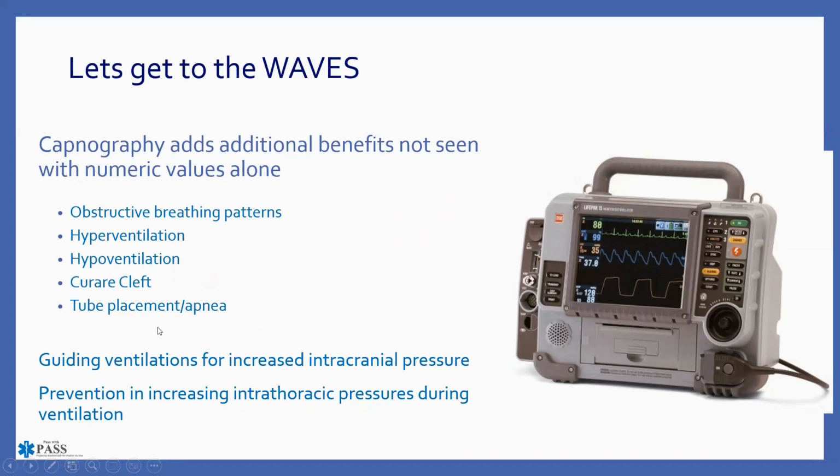Capnography can also be used to guide ventilations for increased intracranial pressure. You have heard this at some point, hopefully, with regards to your neuro patients, neurotrauma. We don't want neurotrauma patients to end up creeping up their CO2 levels. We would actually like for their CO2 levels to be on the low end of normal.